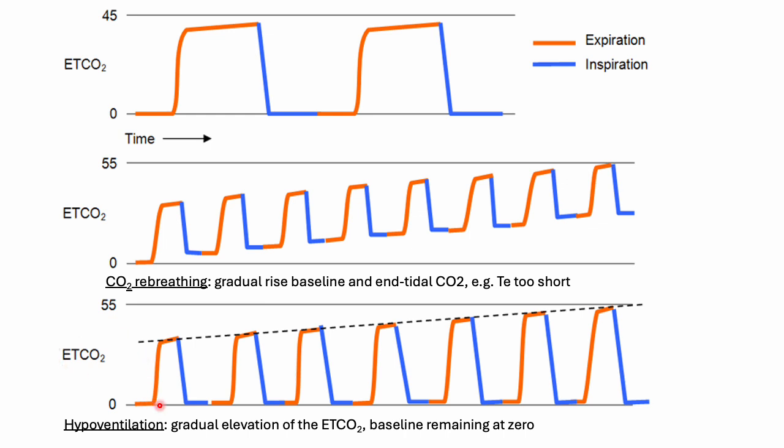What you will see is the end-tidal CO2 will increase, right? Because your PaCO2 accumulates in the bloodstream, so therefore your EtCO2 correspondingly will also increase. And this is what this graph suggests. Then there is an increase in CO2 telling us that the patient is not ventilating sufficiently.